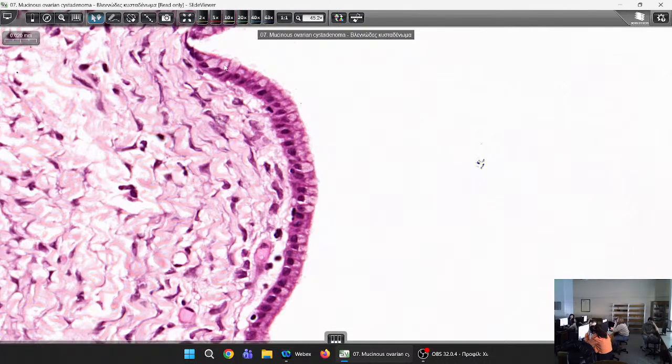Where could a neoplasm be and cause mucinous ascites? Where can this be? It spreads in the peritoneum, and you'll have ascites, and the fluid will have mucus. It won't be serous. It won't be an exudate like the serous cystadenocarcinomas. Do you know which organ? You have to look very carefully.